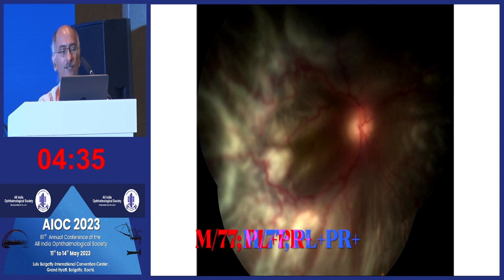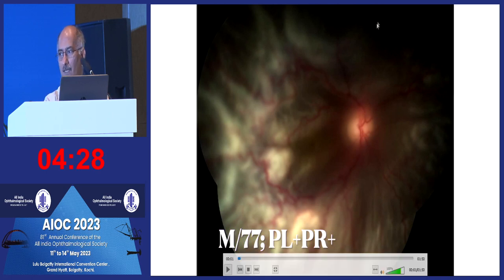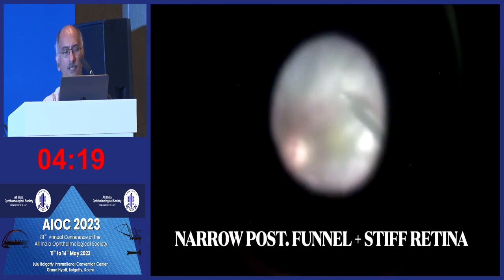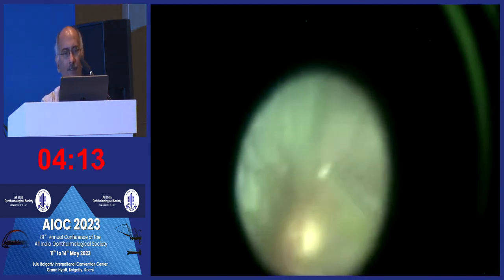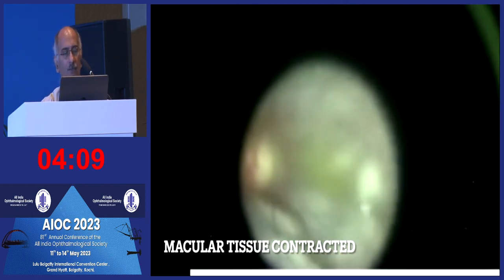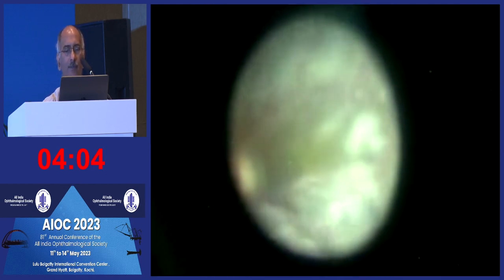Let's play the video. So this is a 77-year-old patient who refused to agree that he wasn't seeing in one eye and presented very late, though there was perception of light and projection was accurate. There was a narrow posterior funnel. There were no obvious membranes to be peeled. I tried with the pick, the diamond-dusted scraper.